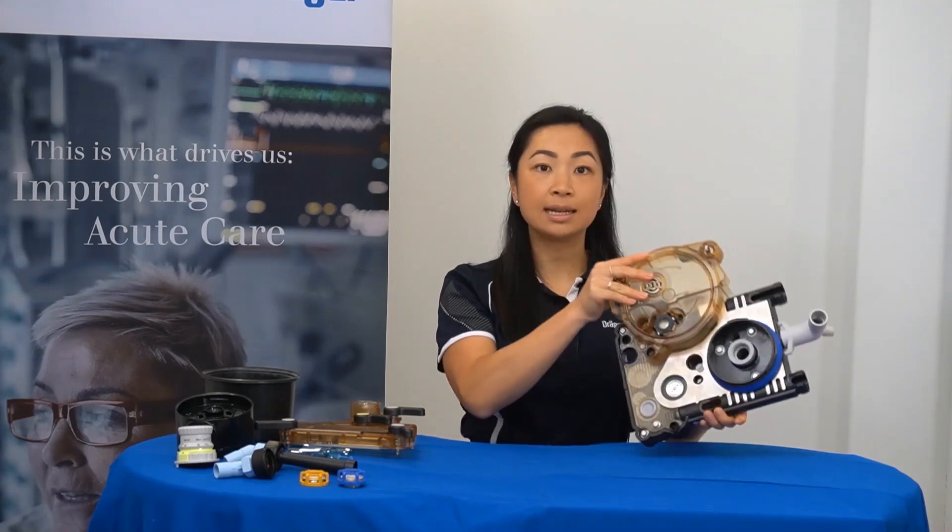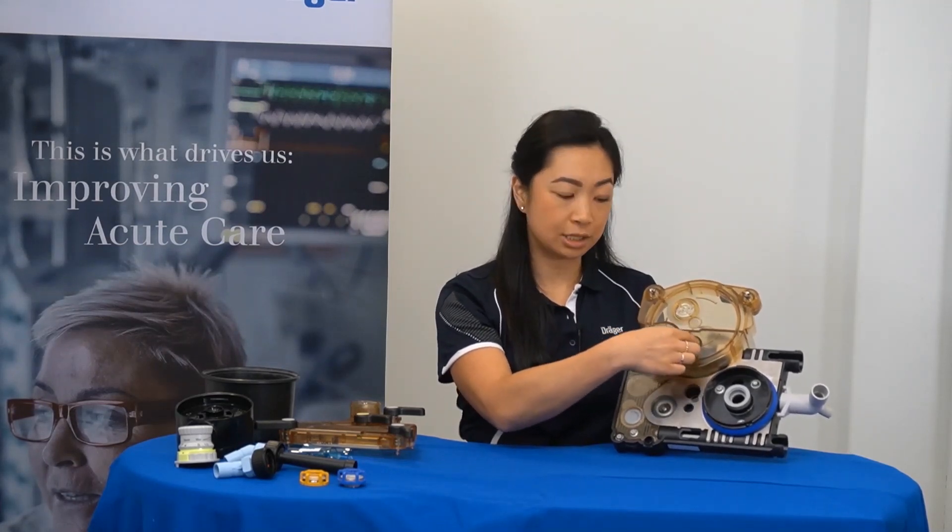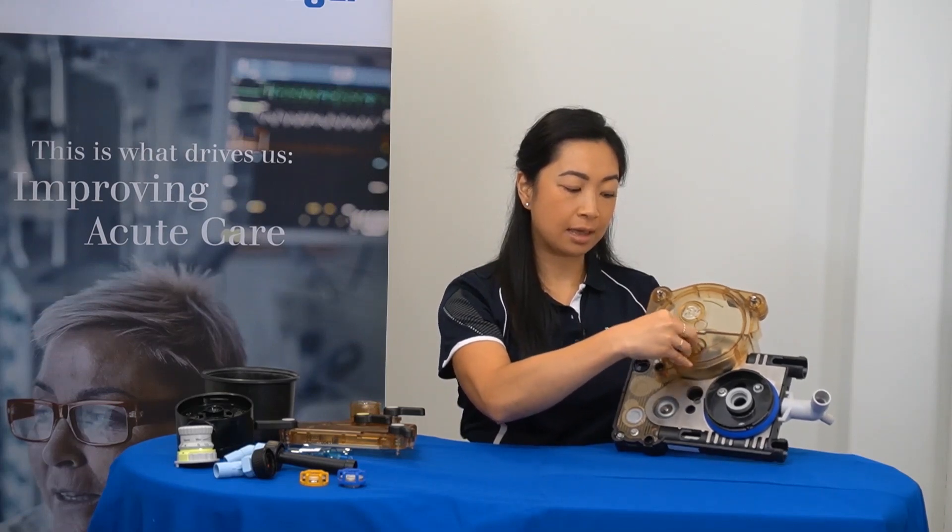Now, on the underside of the breathing block, you'll find the decoupling valve that is black in colour. To remove this valve, a slight anti-clockwise turn and then pulling it out.